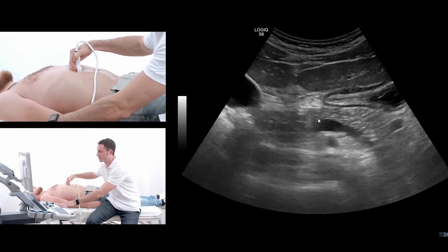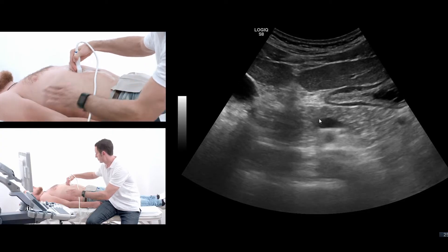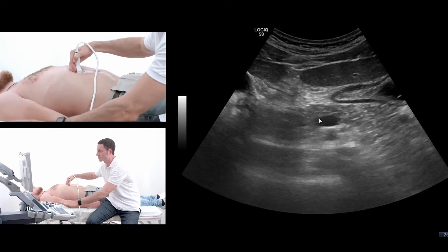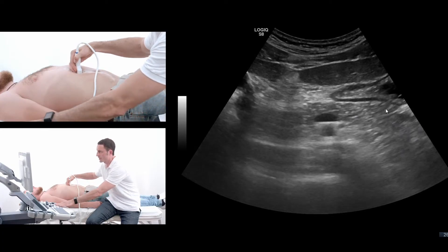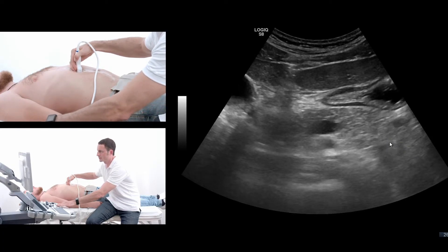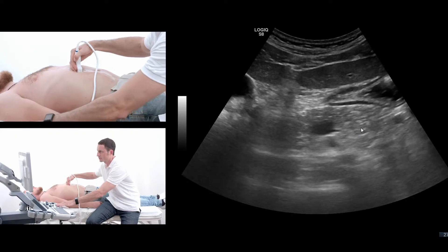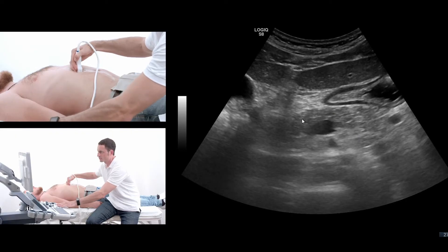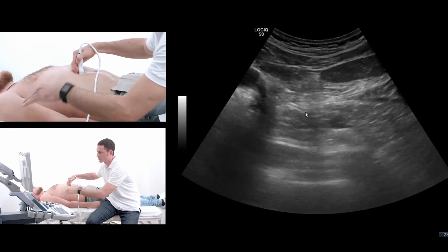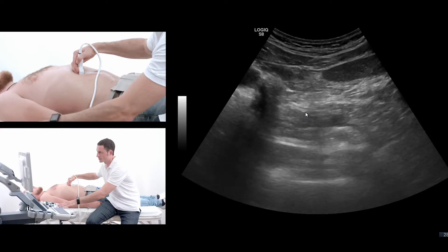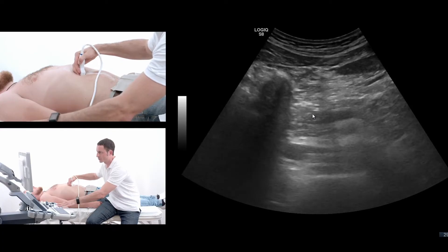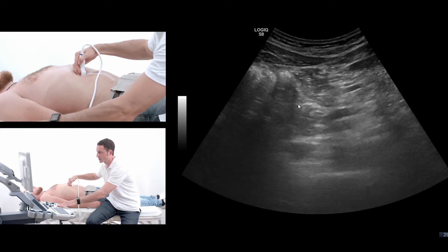When I position the probe in this position, I can see the pancreas tail going back, the pancreas body in the front, and when I move a little bit more to the patient's right side and downward, I can see the pancreas head.